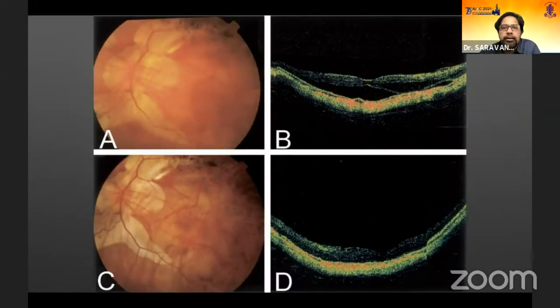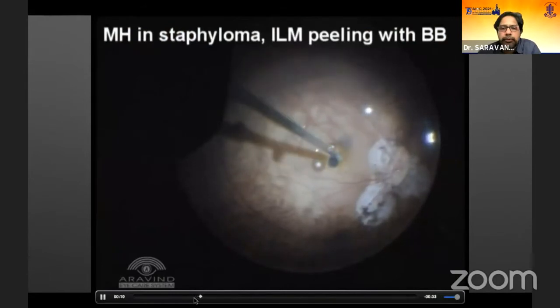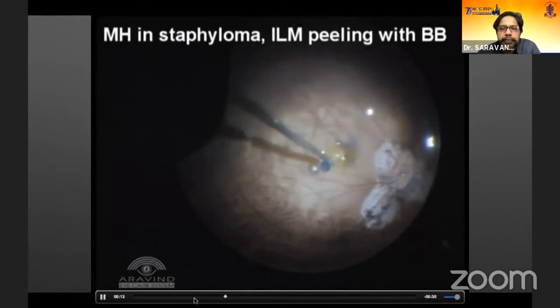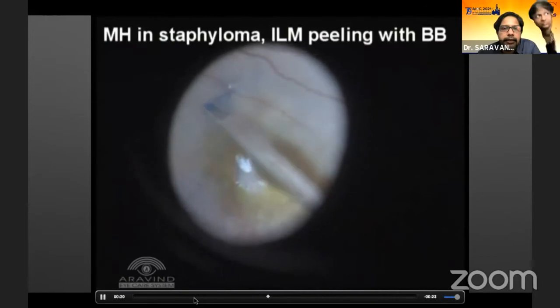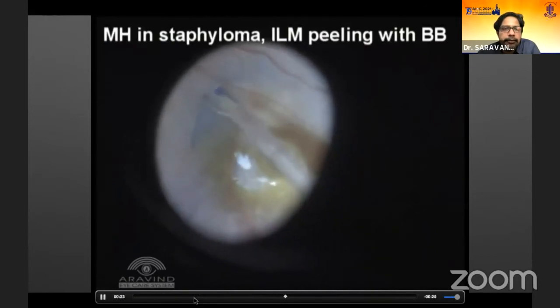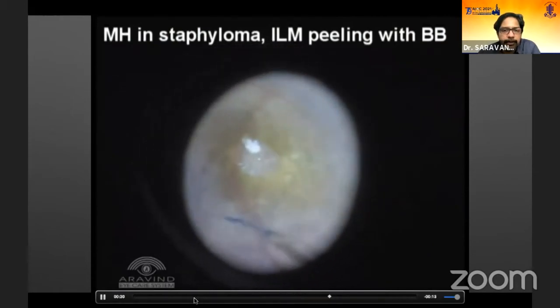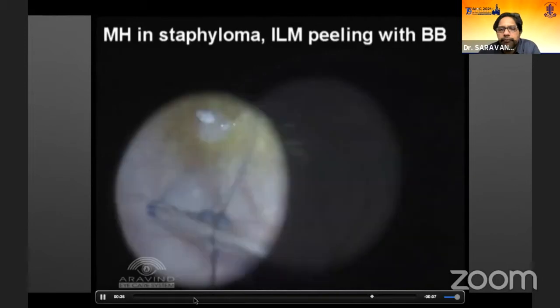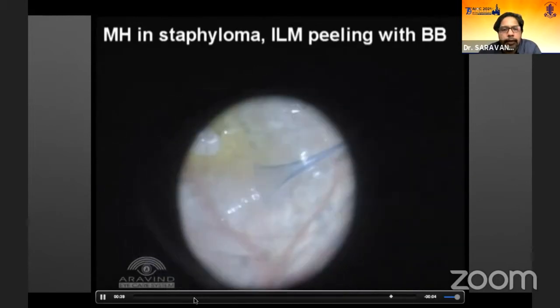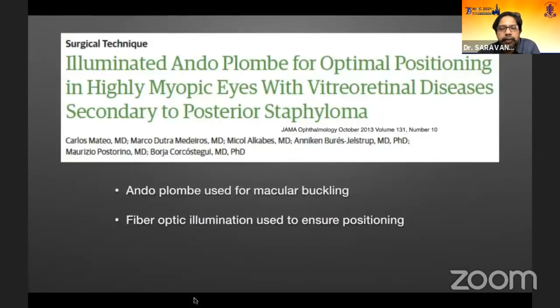The presence of the posterior hyaloid is almost transparent and very thin. Here you can see a posterior pole large macular hole. We have already placed PFCL bubbles inside. I'm staining the ILM using BBG dye under the PFCL. Here I'm picking up the ILM and trying to peel, and I realized there is something hindering — a transparent membrane — which is the residual posterior hyaloid, very thin and transparent, unlike what you would normally see in a routine patient. In almost all high myopia patients, what feels like a PVD is not truly a PVD. Now I'm peeling the ILM after peeling the hyaloid. Always make sure you identify the thin hyaloid membrane below the so-called PVD and address it.